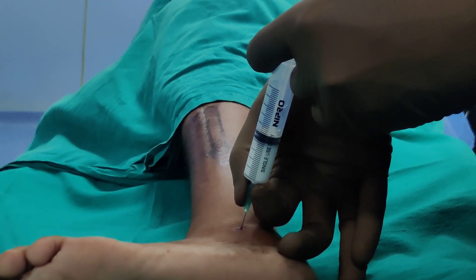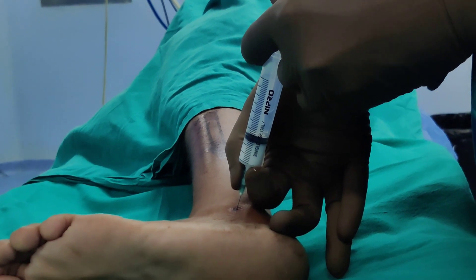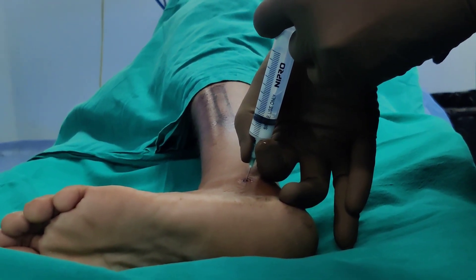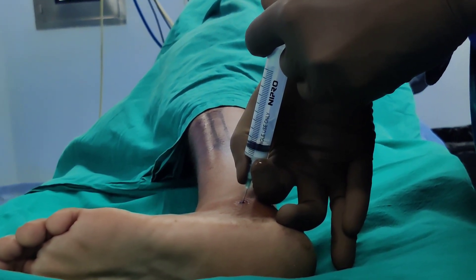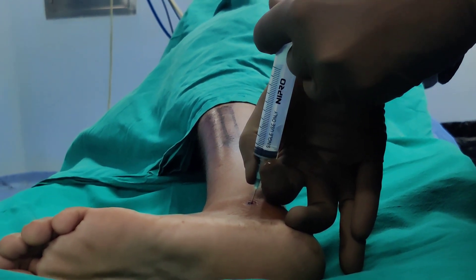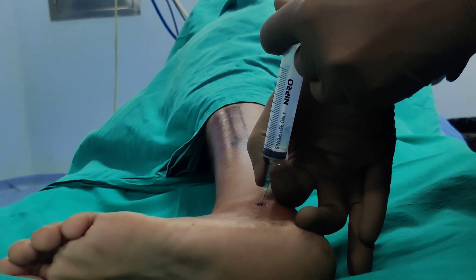Now I am going to inject the local anesthetic and steroid into the joint. It should go reasonably easily, and that is how you inject a subtalar joint.